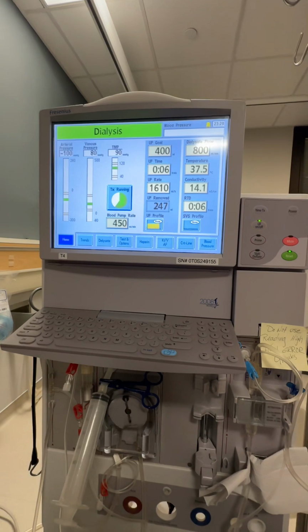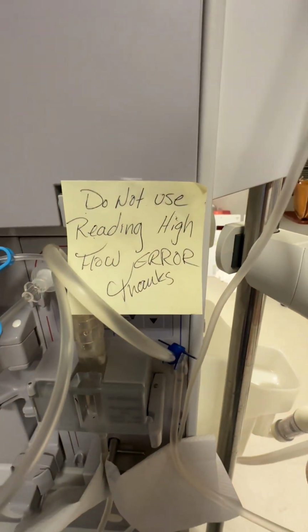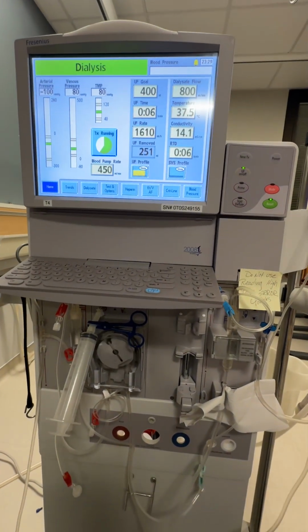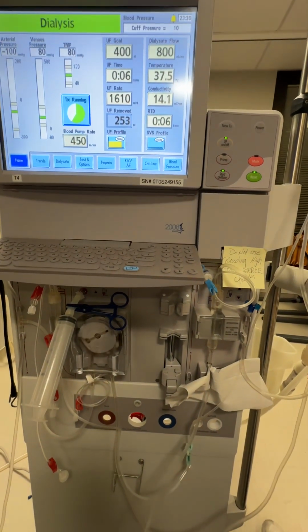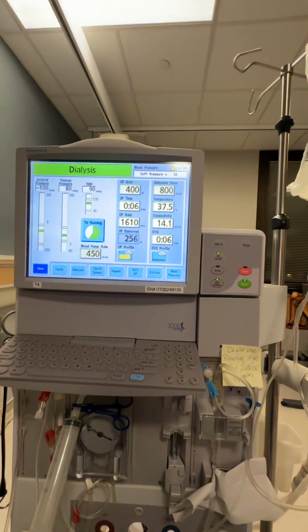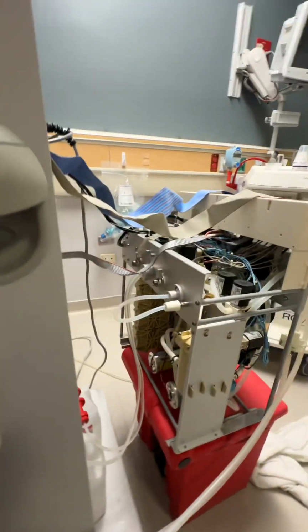So basically I need more input. High flow error. High flow error when? High flow error after the 2nd treatment, late in the day. High flow error when I'm going through test. High flow error in the middle of my treatment. I'm running on a 2K, a 3K. I have a large goal. The only thing I can think of is air.